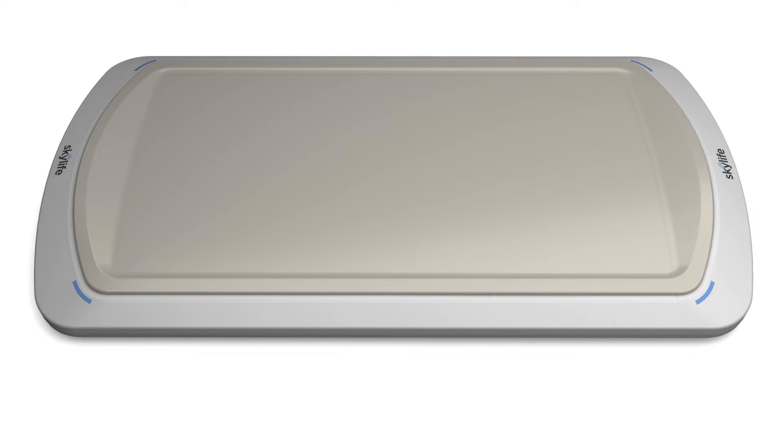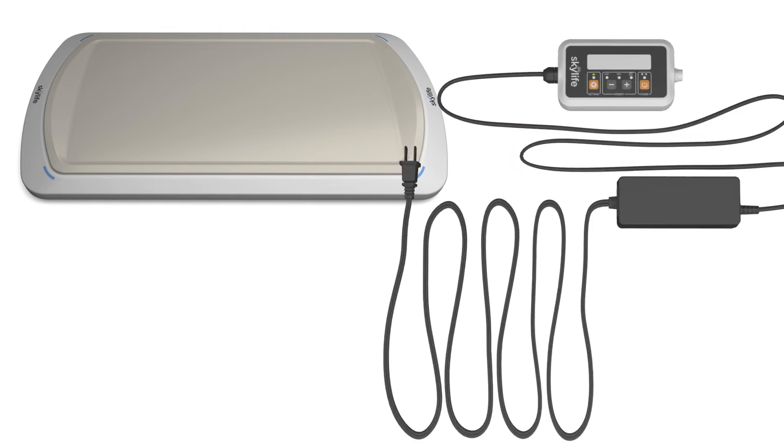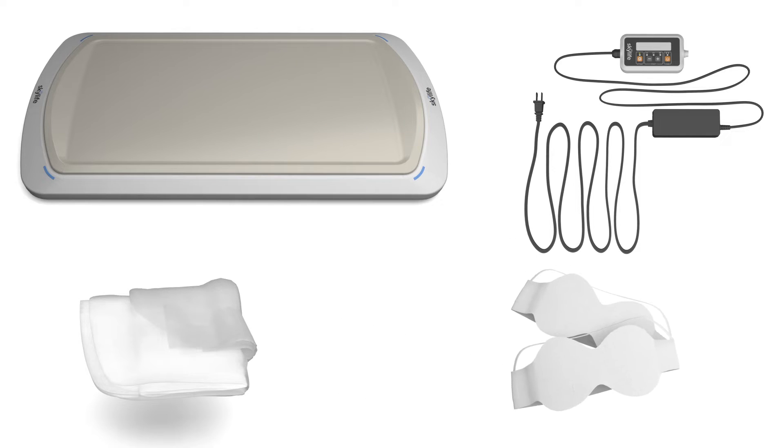When removing the SkyLife from its package, please ensure that you see these primary components: the SkyLife phototherapy unit and the controller with power supply. You should have also received Cloud Cover Plus and infant eye protection with the SkyLife phototherapy system.